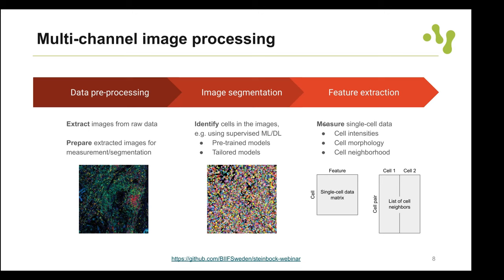The online documentation shows that for segmentation you would type 'steinbock segment deepcell' with some parameters. You also get full documentation built into Steinbock: adding '--help' to any command shows available sub-commands. For example, 'steinbock segment --help' reveals sub-commands 'cellprofiler' and 'deepcell', and you can navigate through commands to see all available options.